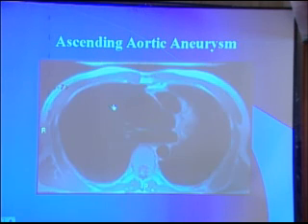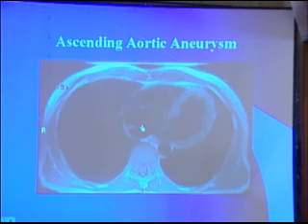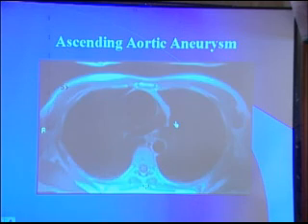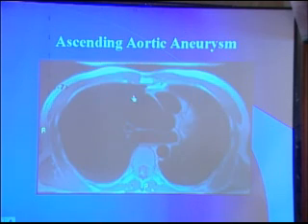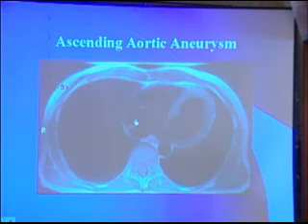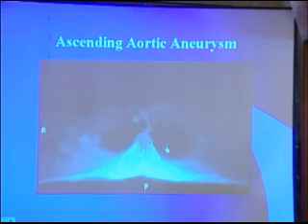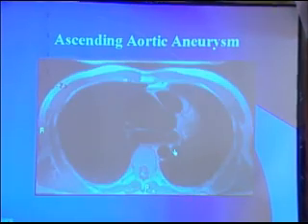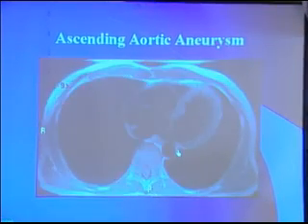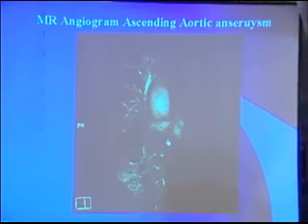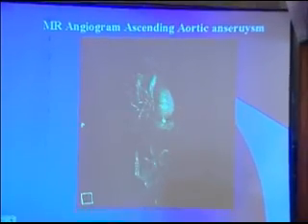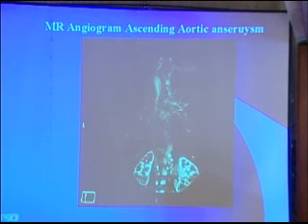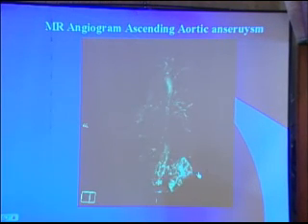Typical ascending aortic aneurysm — massive, almost two and a half times the pulmonary artery. Very, very thin wall. Dilated. No significant atherosclerotic disease. And the MR angiogram showing a nice dilated aorta with no other abnormality.